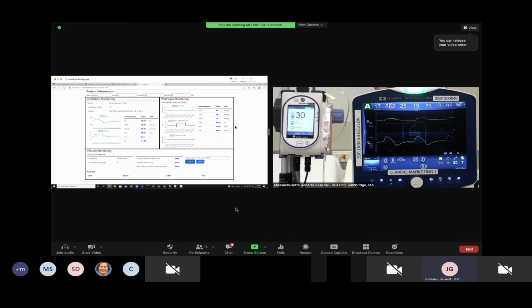Please let us know if you need anything else. We're on standby to help at any point. Okay, great. Thank you very much. End simulation.